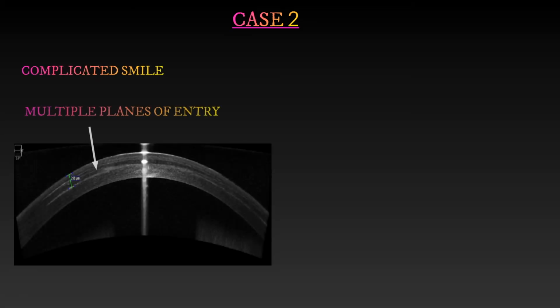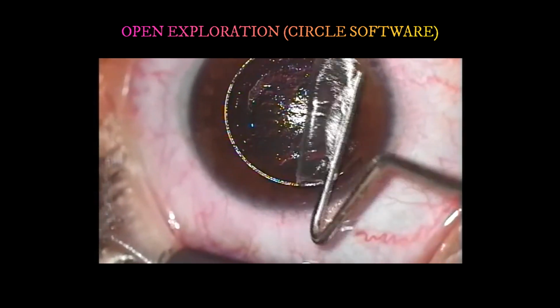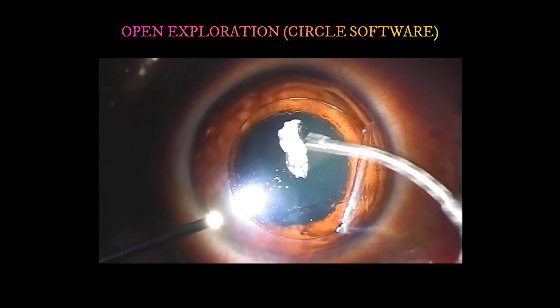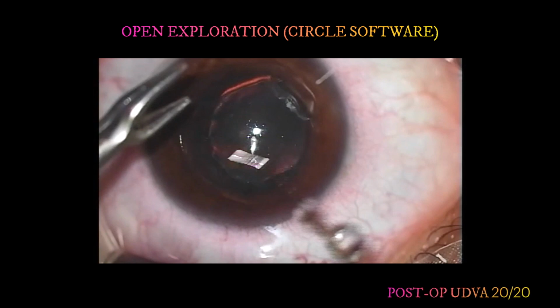Another case of complicated SMILE revealed multiple planes of entry and a prominent false plane on ASOCT posterior to the lenticule cut with complete retention of the lenticule. In view of the multiple entry planes, open exploration with Circle was preferred and an endo-illuminator assisted lenticule separation was performed, resulting in full recovery of visual acuity.